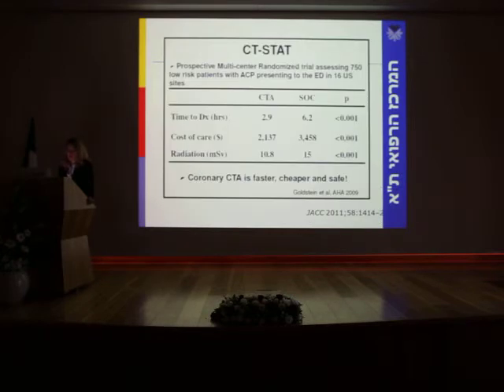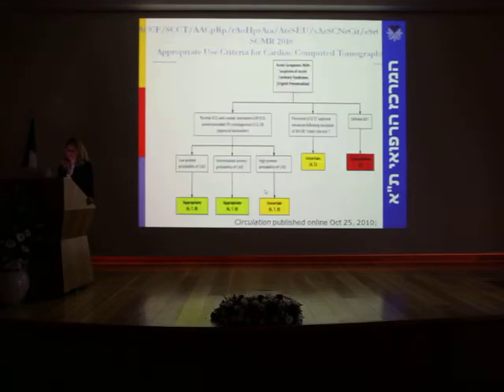And the randomized study, which was much larger, in 16 US centers, which did almost the same, showed the same results, and they state coronary CTA is faster, cheaper, and safe.